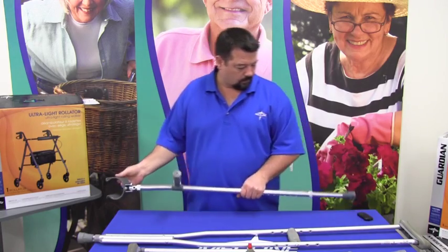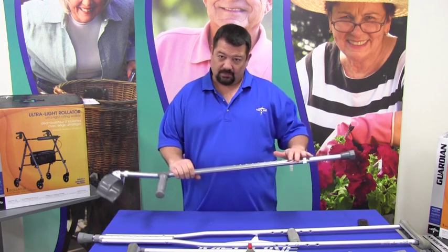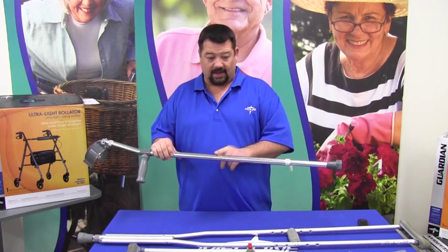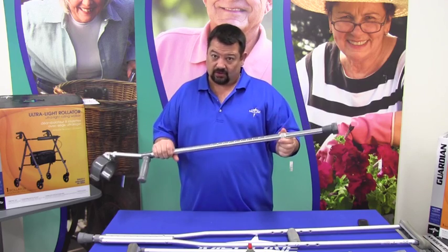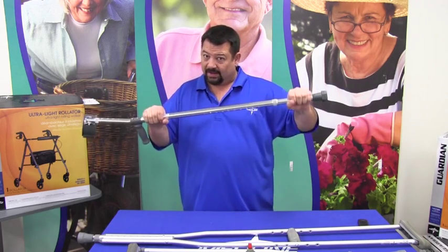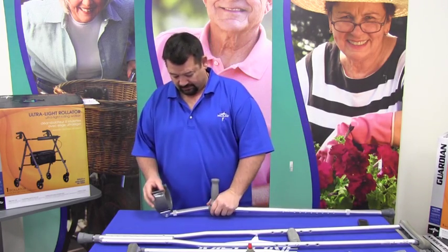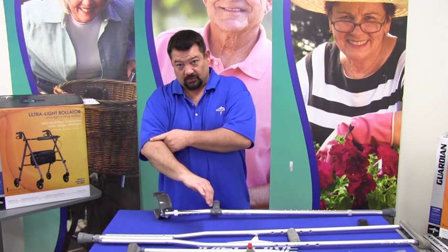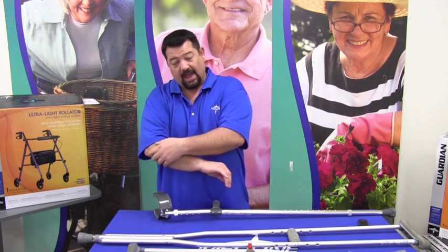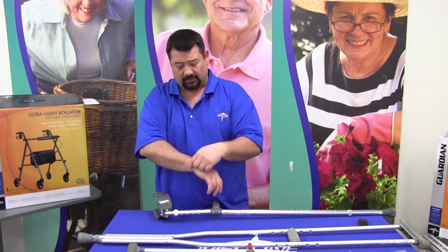Now, for the cuff, let me take a step back here. Once you have the height adjusted, tighten this collar so that it's secure, with no rattly noises. Now for the cuff, again, we want to have the cuff somewhere between the elbow and the wrist, and most common is about 1/3 of the distance down between the elbow and the wrist.